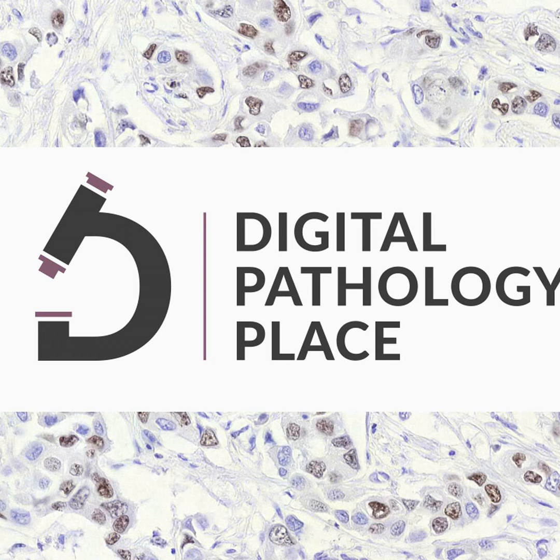There are many, if I talk about unsupervised, everybody wants to have an unsupervised AI. Basically, you just throw in data and it tells you what to do. I wouldn't really recommend that with cancer. Do you let your kid loose on the internet to self-learn what the world is? We don't let humans do unsupervised learning. The whole school system is strictly supervised. So there are many practical problems with unsupervised learning. Everybody wants to do it because it seems that easy: just throw in data and it self-learns. There are really few practical applications that can be done with unsupervised learning.